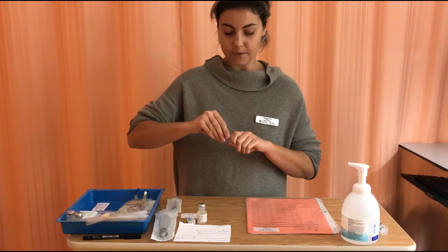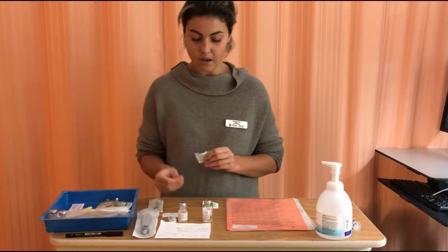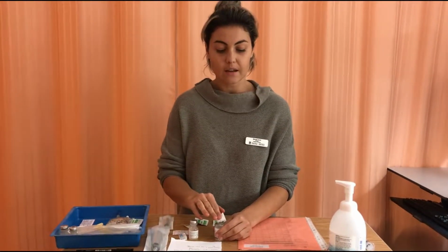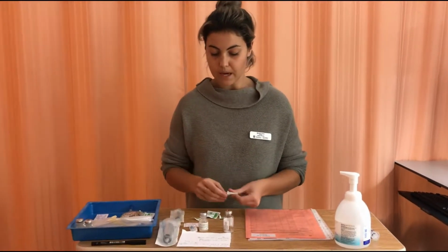Open my vial caps. I'm going to perform, just using an alcohol swab, cleaning the top of the vials. I would clean it for 30 seconds and let it dry for 15, but for the sake of time for the video, I'm not going to be doing the full minutes.